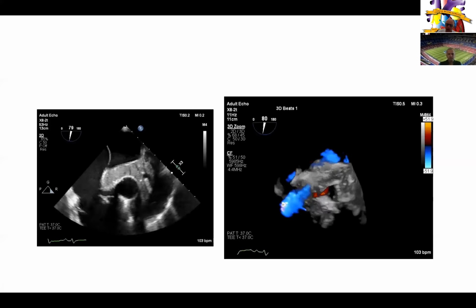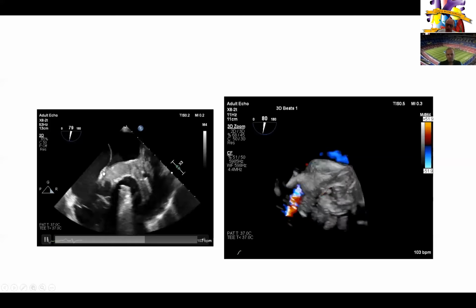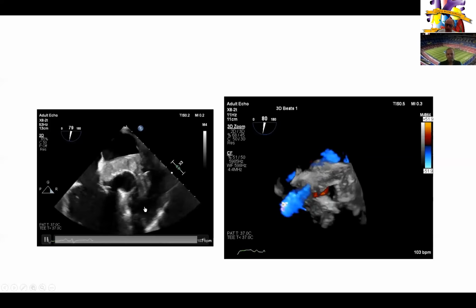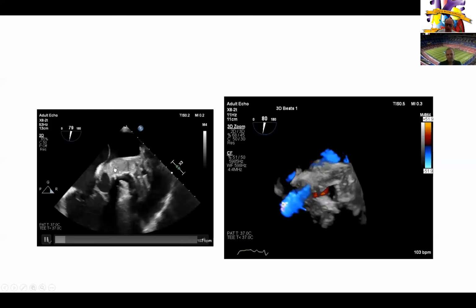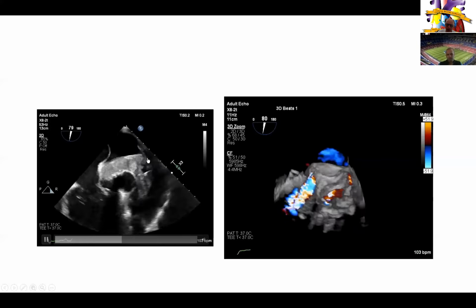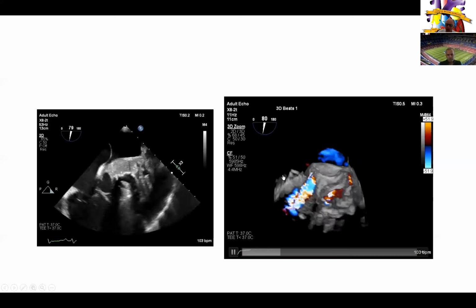Yeah. So this is important. You got those images, so thank you so much. But it's important also not to just focus on one area, to make sure you interrogate the color all around the aortic valve, because sometimes the defect can enter into the pulmonary artery here. It can enter into the RVOT. It can enter into the RV. So this is not a congenital defect. This is a defect that's acquired, and it depends on what the infection tracks and affects, where it goes.